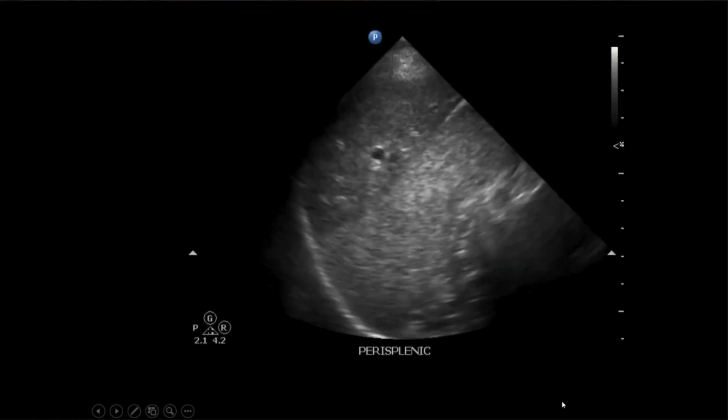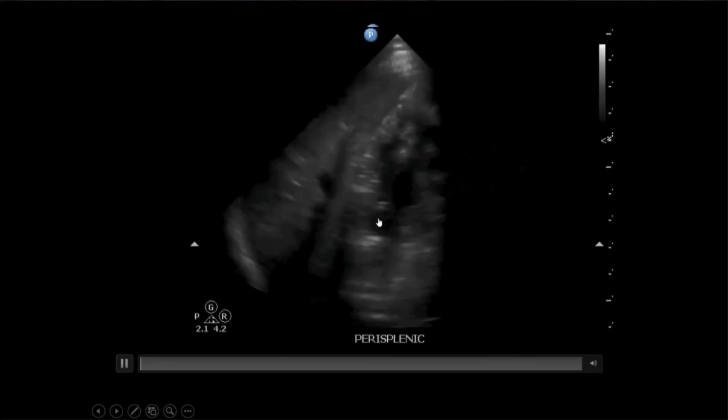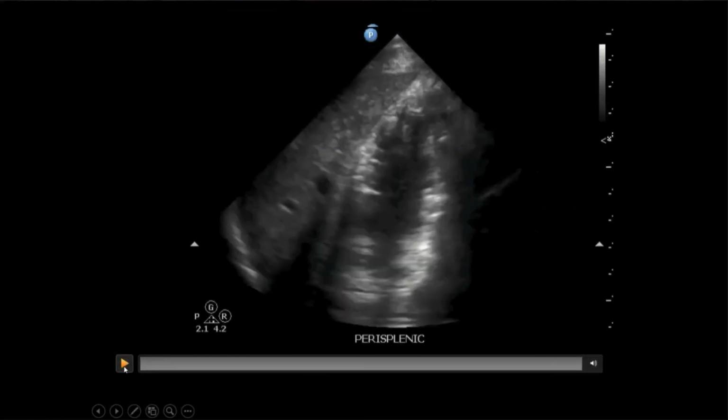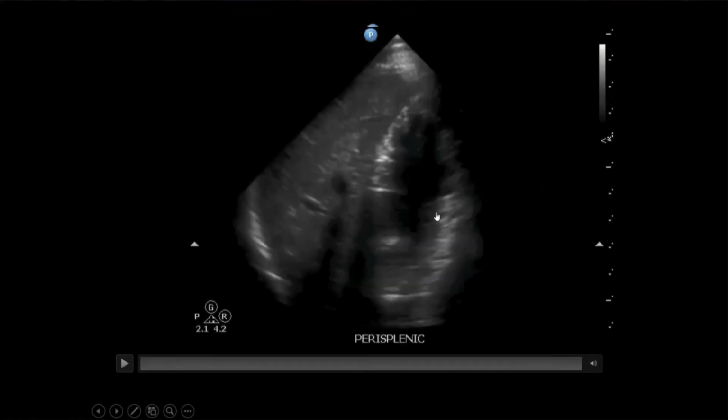Excellent. And now, Ziad, this is your favorite thing. So we have the spleen here, and then we have this other structure that's got fluid in it. So this was somebody who just drank a couple beers before they came and you did the FAST. So this is in your stomach. So you're just too far anterior, and if you angle more posteriorly, you'll find the kidney.